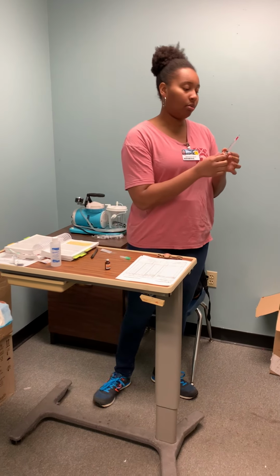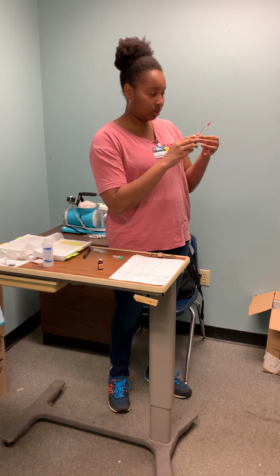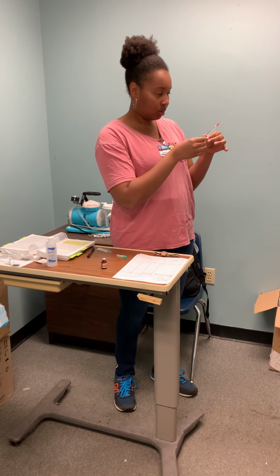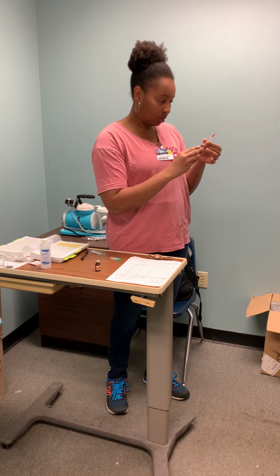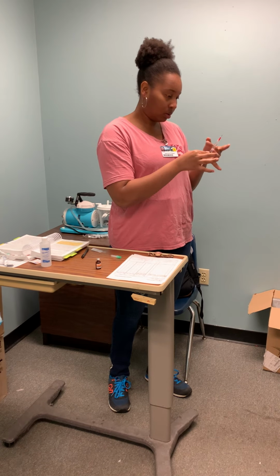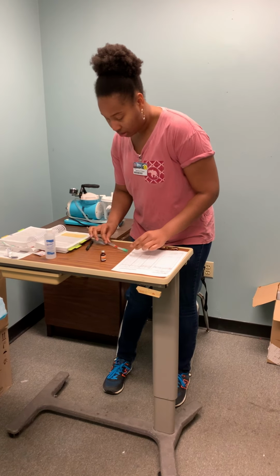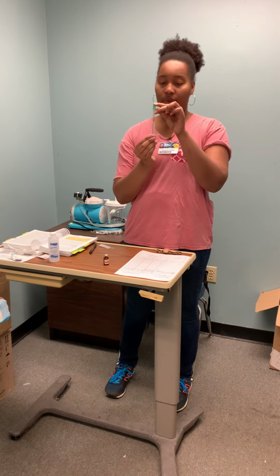Then make sure I don't have any air bubbles. All right, this is 3 milliliters.